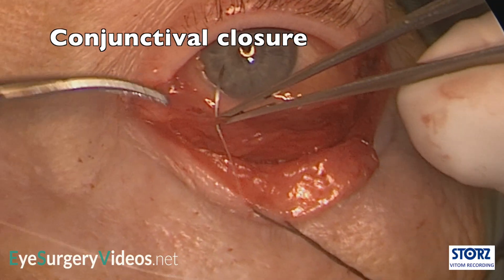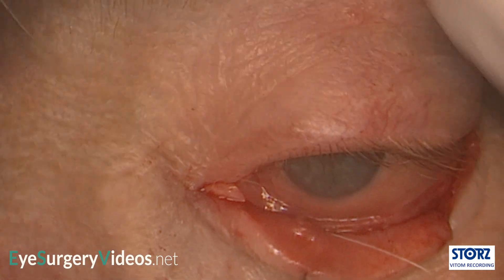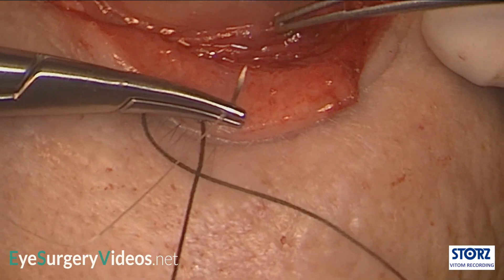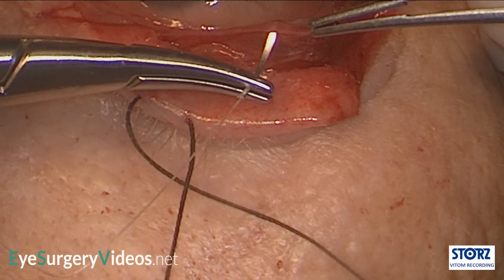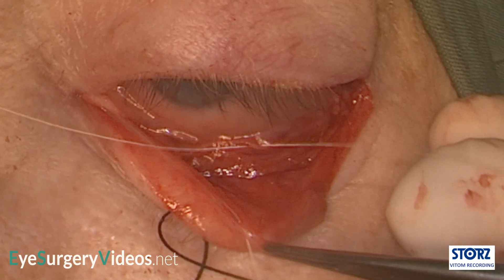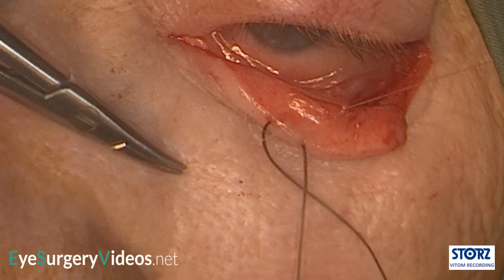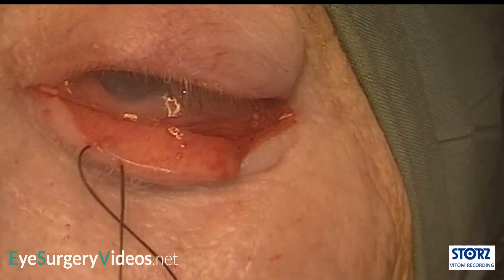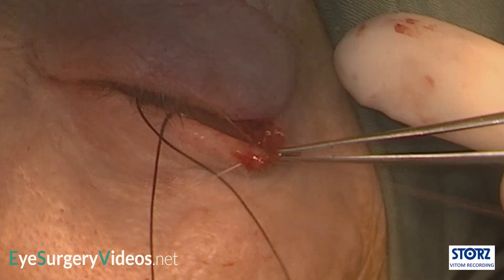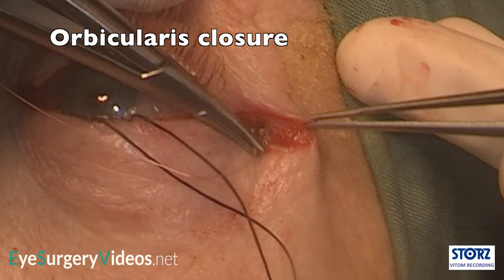Less is probably more with closure. The periosteum can be closed if required, although it is frequently not necessary. The tarsal conjunctiva is repaired with 7- or 8-0 Vicryl. The retractors are not separately repaired, as overzealous or crude retractor repair probably increases the likelihood of entropion. The lateral canthus is reformed and the lateral canthal tendon can be repaired, although this suture may also not be necessary if the tissues are neatly approximated and the canthal angle nicely reformed. Orbicularis and skin are then closed.